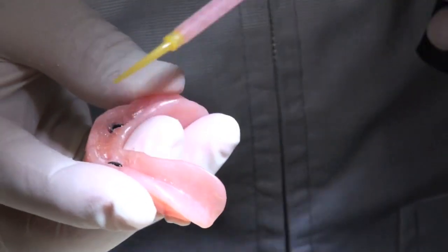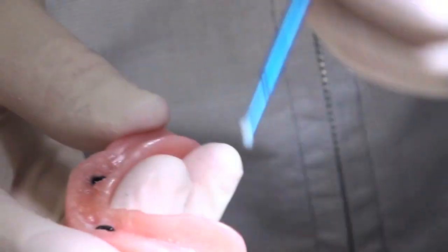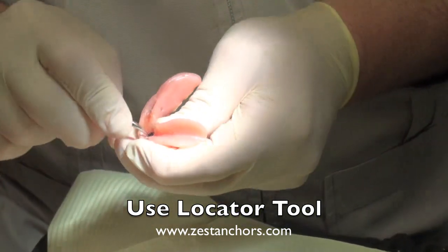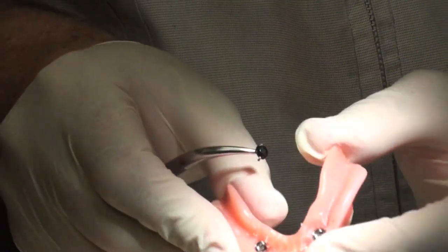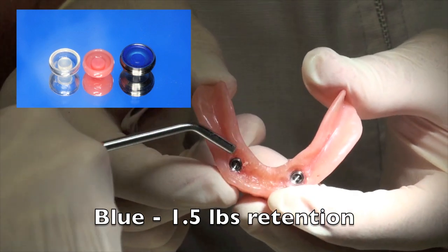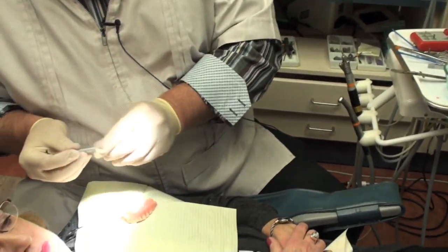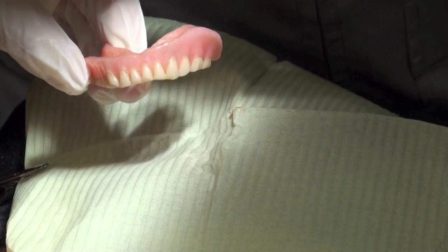Once we're done, we check for any voids around the housings. You can see a little void here, so I'll add a little bit more resin, light-cure it, and make sure they're fully secure. You can smooth it out with a little micro brush as well. It's now time to take out the black impression caps and add the resilient caps. The resilient caps have certain pounds of pressure based on their color — we're going to put the blue ones in, which is a 1.5 pound pressure. This gives a certain amount of snap, and most patients like the blue; it's a good place to start.